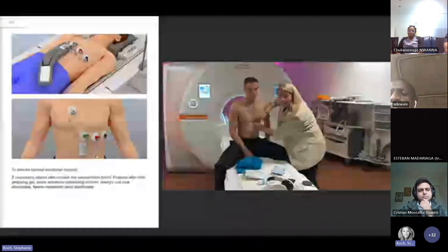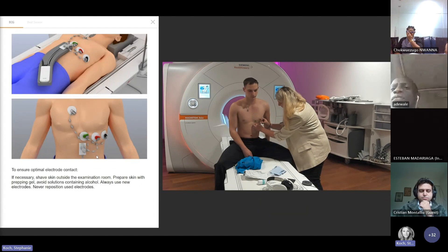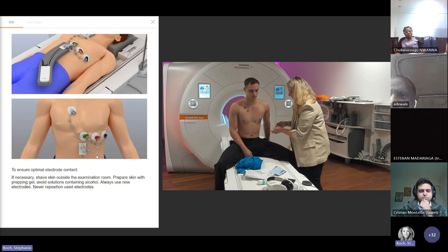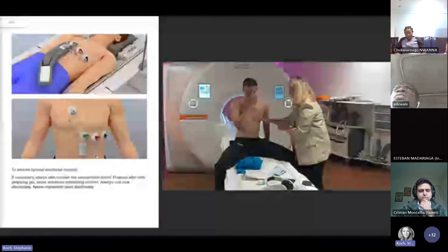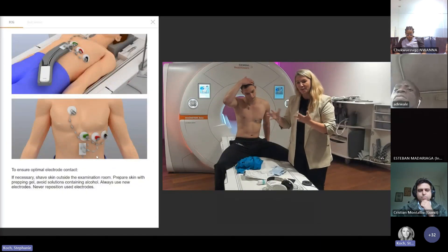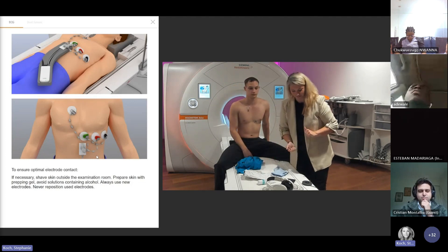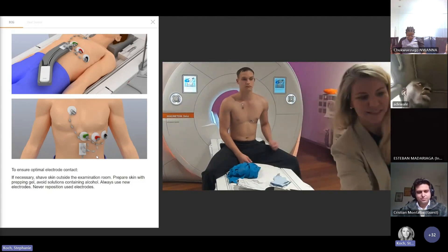Sometimes it's a little bit tricky when you have, for example, a large chest. For this we have the beat sensor, of course. Then I have my press line and choose the other one. Also try to push it really good so that I have a good adhesion here, and the other one goes a little bit on the side. You need to find out how you can do it, because every patient is a little bit different. Maybe you can give me the ECG. Thank you.